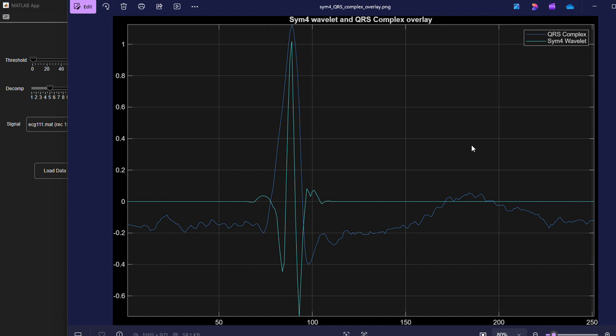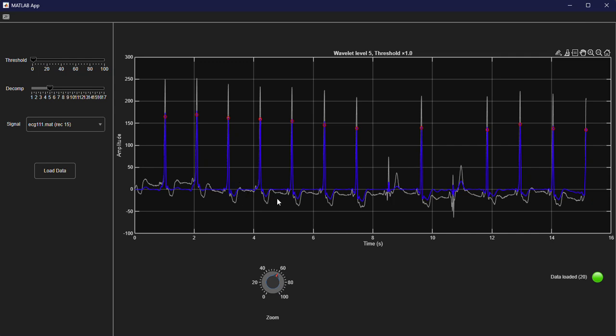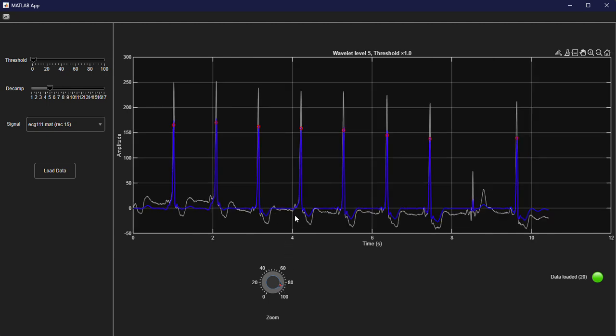We store the coefficients of that decomposed signal into a matrix, which is then passed through an inverse maximal overlap discrete wavelet transform. We apply some thresholding and denoising to remove any signal noise, which is evident here when you compare the raw with the filtered signal.